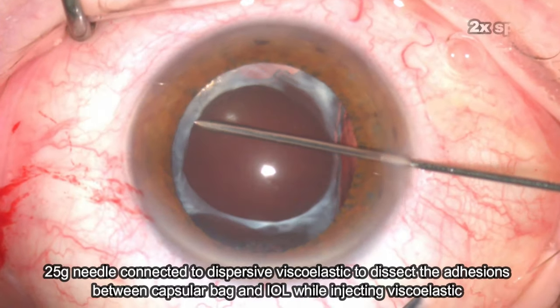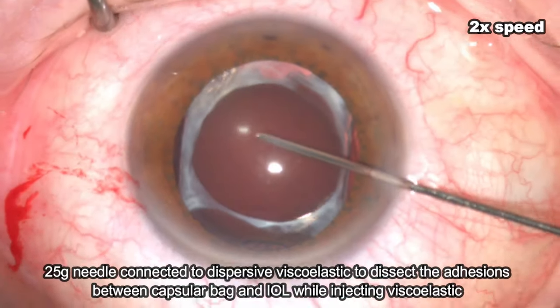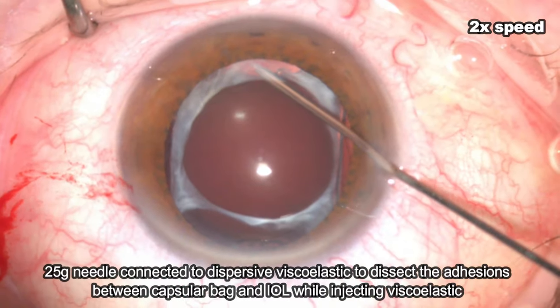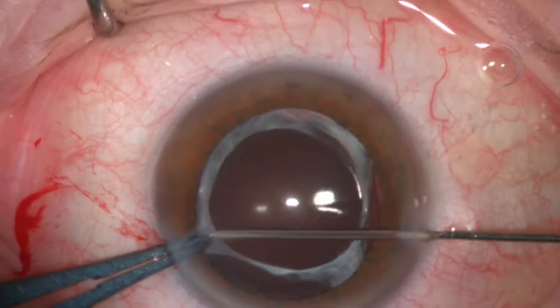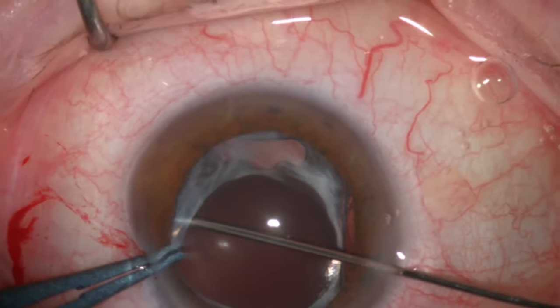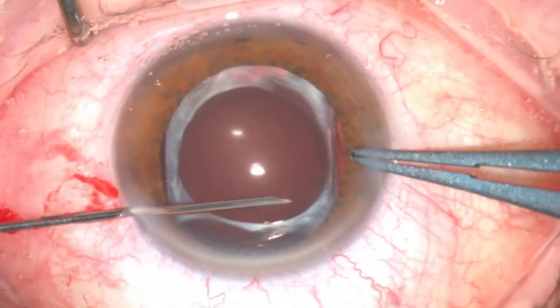The surgery was started by visco-dissection of the adhesion between the anterior capsule and lens implant using a 25-gauge needle connected to a dispersive visco-elastic. The sharp tip of the needle was used to break up the adhesions 360 degrees between the anterior capsule and the lens implant by gradually sweeping the needle side to side in all directions while injecting visco-elastic.